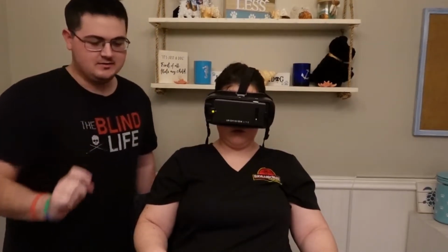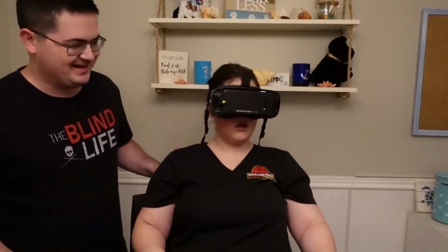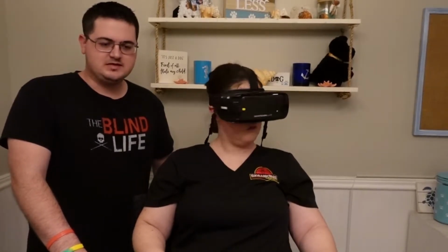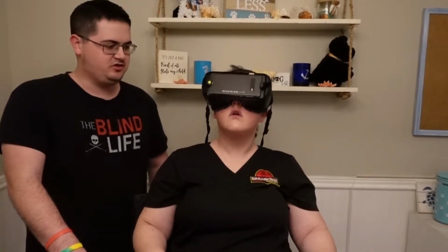Sometimes if you click, like that one, hold on for a second. We're not going to stay on it for too long. We just gotta read. But yeah, sometimes if you click the button a little too fast, it might switch the modes. So you gotta pay attention.